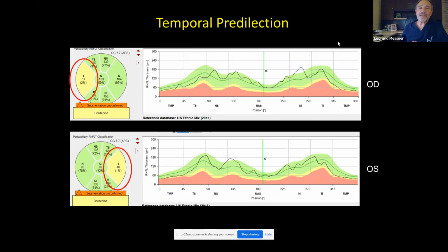But what's more important than that is following them over time. And I like to see these patients on a 6-month basis. It's pretty easy to get them in 6 months and simply repeat this non-invasive OCT. And what we're looking for is progressive thinning over time. So you've got to get those reports back to neurology. Is the OCT stable or is it progressively thinning down?